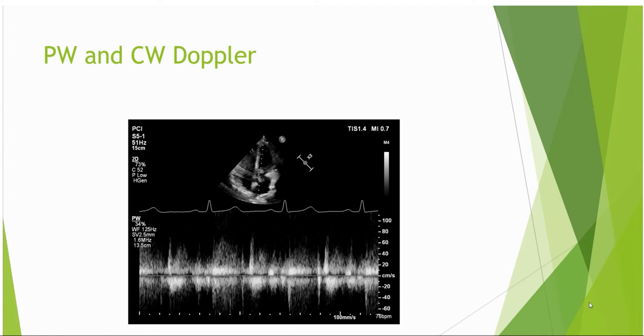Gate size is another important feature to consider. When in pulse Doppler mode, the beam moves up and down the entire line of sight. However, the machine will only listen at a specific time interval, the range gate. Decreasing the range gate makes the sample volume more specific. This is useful if there are two different flows in the field of interest. A smaller gate size will hopefully obtain only the desired flow.